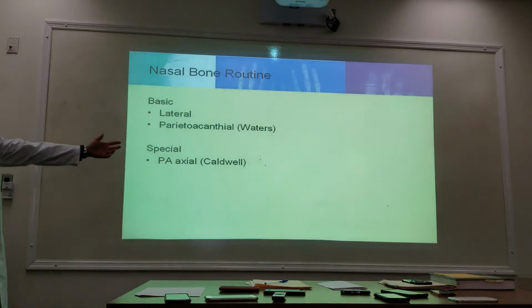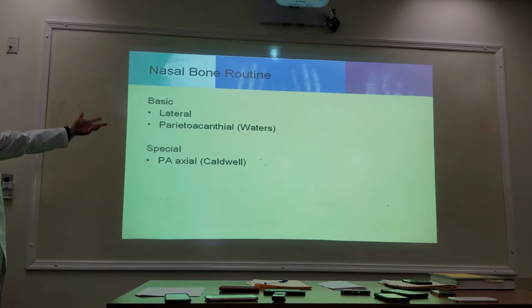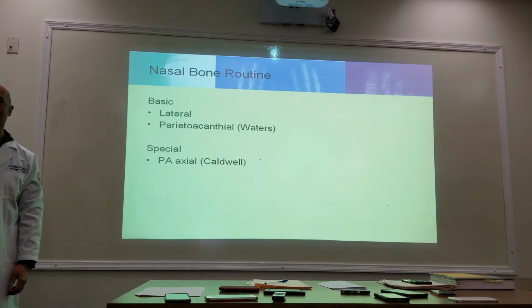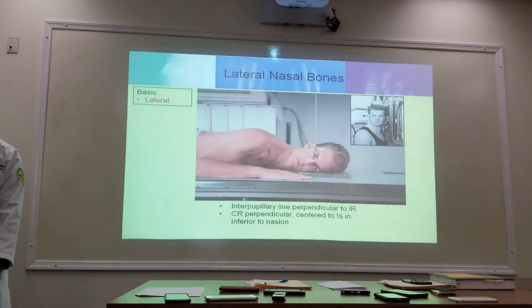All right, look, same views again. Now we're going to look at the nasal bones. Lateral, Waters, Caldwell. See how easy that is? It's just the same views over and over again.